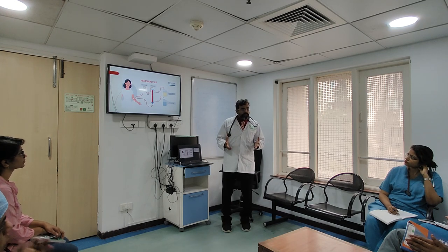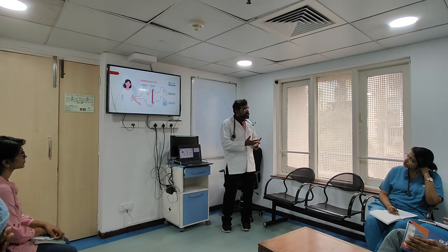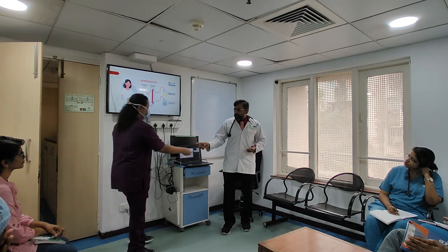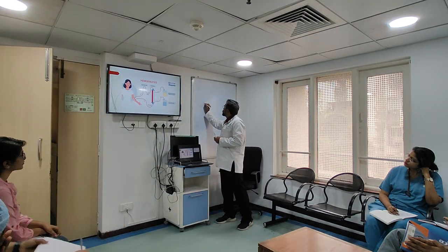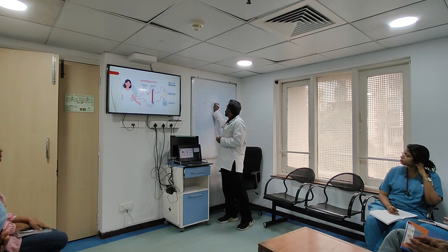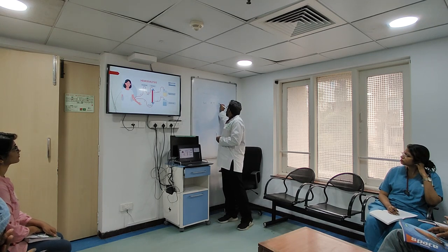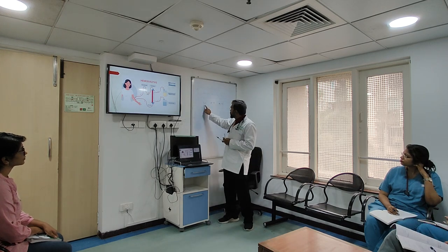Now you are on the rounds, and as we do our rounds, we actually see our patients who dynamically change. Now we decided to start the dialysis at 3 p.m. Okay, at 3 p.m. we started the dialysis, and the orders were UF of 1.5 liters, and the dialysis was for a total of 3 hours. Say for example, we started this at 3 o'clock.